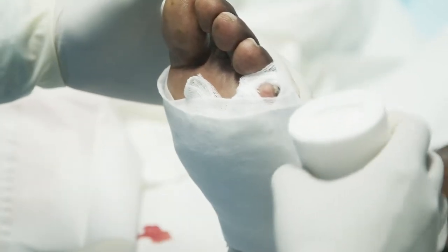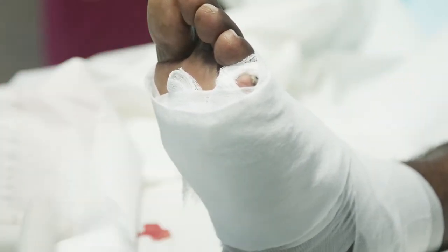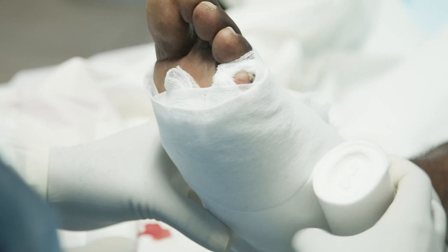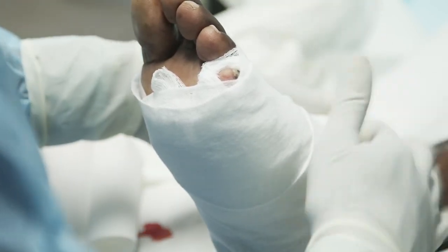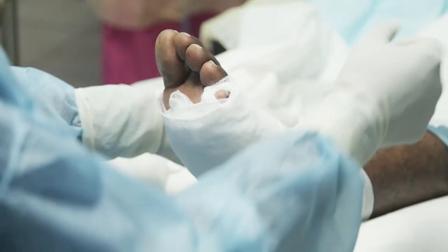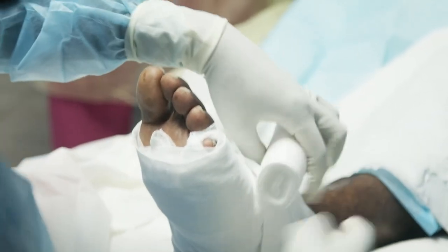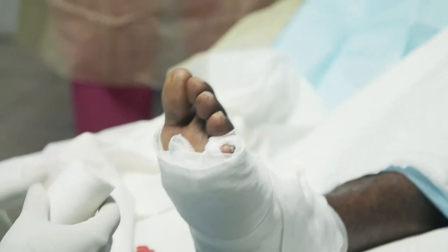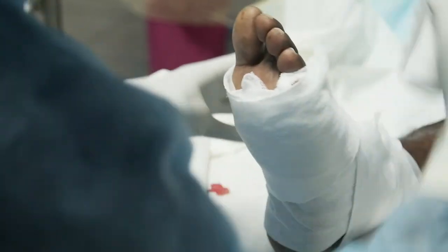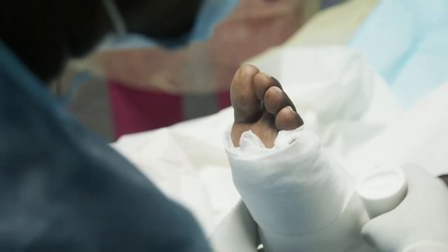And ain't no fancy machine. You need good sense. Right? And for me, I like to be able to see them. So you're still dealing with high-risk limbs. And we like to make sure, in dressing, the dorsalis pedis runs through the middle here. So I like this to be loose in the front there. Anywhere else it could be a little tighter, but I want to loosen the front. I'll leave that open even, just to make sure nothing's going on. There's a fellow who thinks he's Superman, so you better be a little careful with him. All our patients think they're Superman.